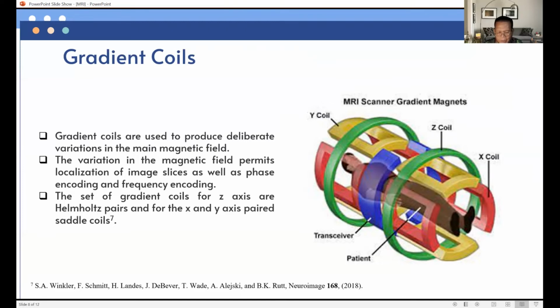These magnets are relatively inexpensive to make, but require a constant flow of current while magnetized and imaging. The coil has an electrical resistance that requires cooling of the magnet. The operating costs are high because of the power requirement of the magnetic coil and the associated cooling system.